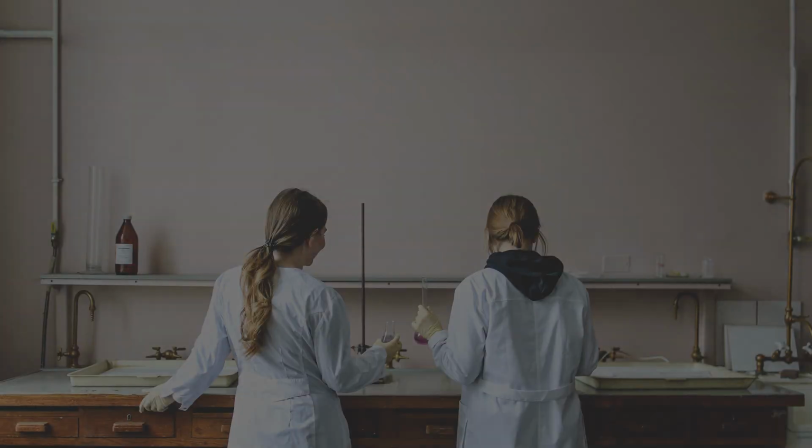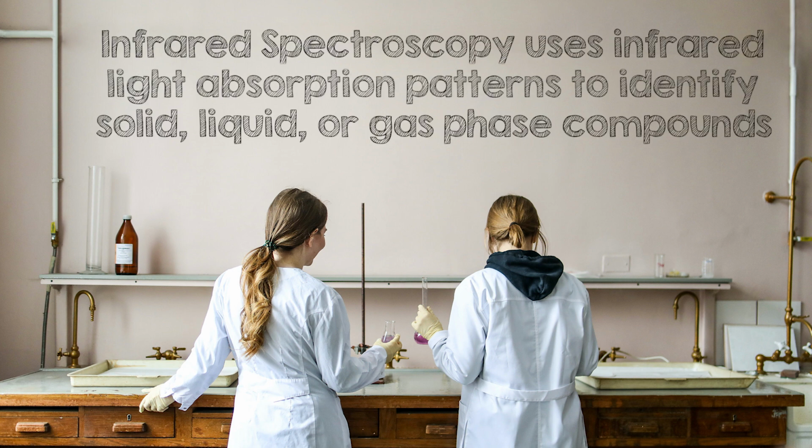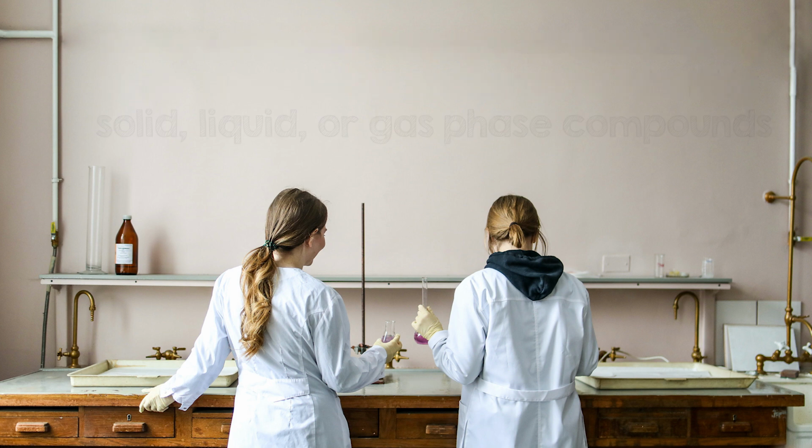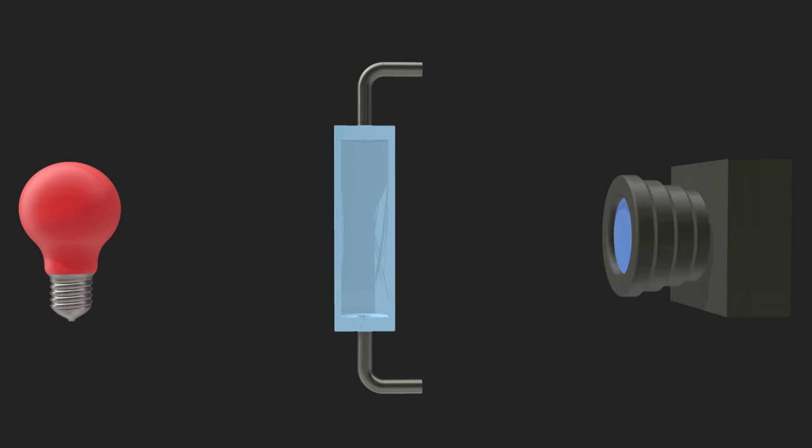As you will recall from your introductory chemistry classes, infrared spectroscopy is a method of molecular identification that, in its most common implementation, uses the absorption pattern of infrared light to identify molecules. Techniques exist to identify solid, liquid, and gas phase compounds. In a simplified model of an anesthetic IR spectrometer, three components are required: a detection chamber, transparent to infrared light through which your sample gas will flow, an infrared light source, and an infrared camera to detect transmitted light.